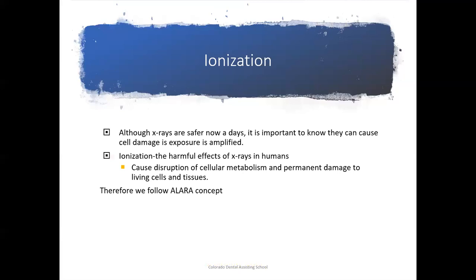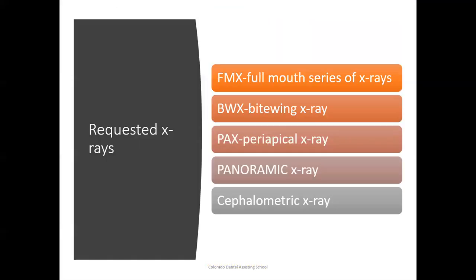If the doctor knows they just had x-rays previously, or let's say they don't have anything going on in their mouth, they don't have any existing restorations, they don't have any caries that we're worried about, we might wait 18 months instead of doing it every 12-month period and wait another couple of months before taking that full mouth series of x-rays or possibly just those 4 bite wings. So every single patient will have an individual treatment plan, which is going to give us that advantage of making sure that we're safe and also that we're providing them the best dental care that we possibly can.